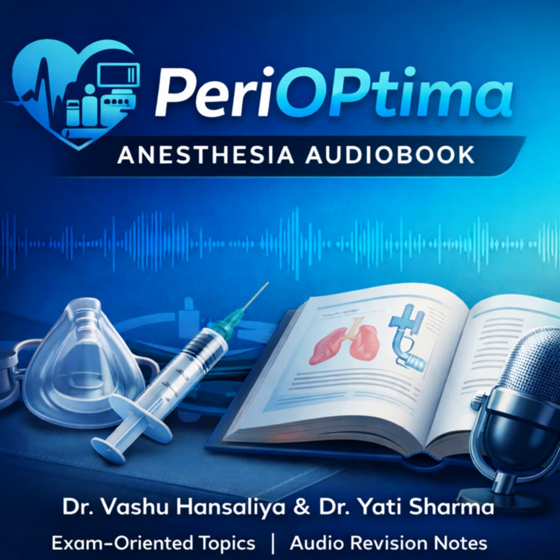Visual aids are powerful mark boosters. What diagrams can be drawn to enhance the marks? Simple schematic drawings are highly, highly valued. You should be able to draw a conceptual representation of the pin index safety system, showing the yoke, the valve, and the pin configuration. Exactly. Show O2 is 2.5 versus N2O is 3.5. And for maximum impact, include a schematic of the Desflurane vaporizer. Clearly label the electrical heater at 39 degrees, the high-pressure sump at 2 atmospheres, and the independent injection port. Contrast it with a conventional bypass flow.